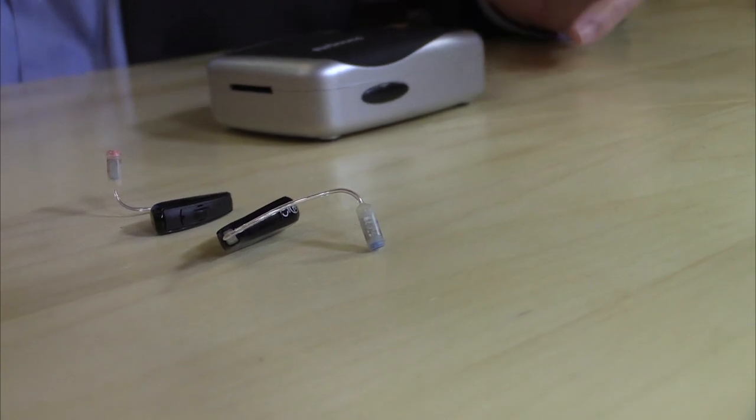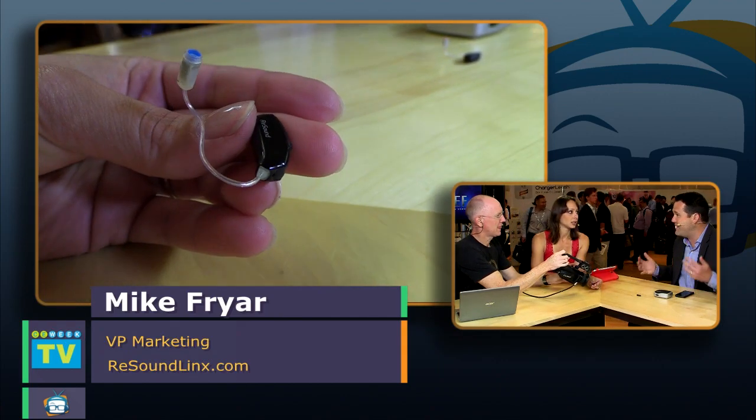Great question. It is a hearing aid, and what that means is its first job is to help people with hearing loss. So if you have a hard time hearing in noisy environments or quiet environments, a lot of people don't realize, 1 out of 10 Americans have hearing loss, so they could be using a hearing aid. And when you get into the ages 60 and over, it's about 3 out of 10. So a lot of people walking around think maybe people are mumbling, or they think that things are just too noisy, and it's because they have a hearing loss.